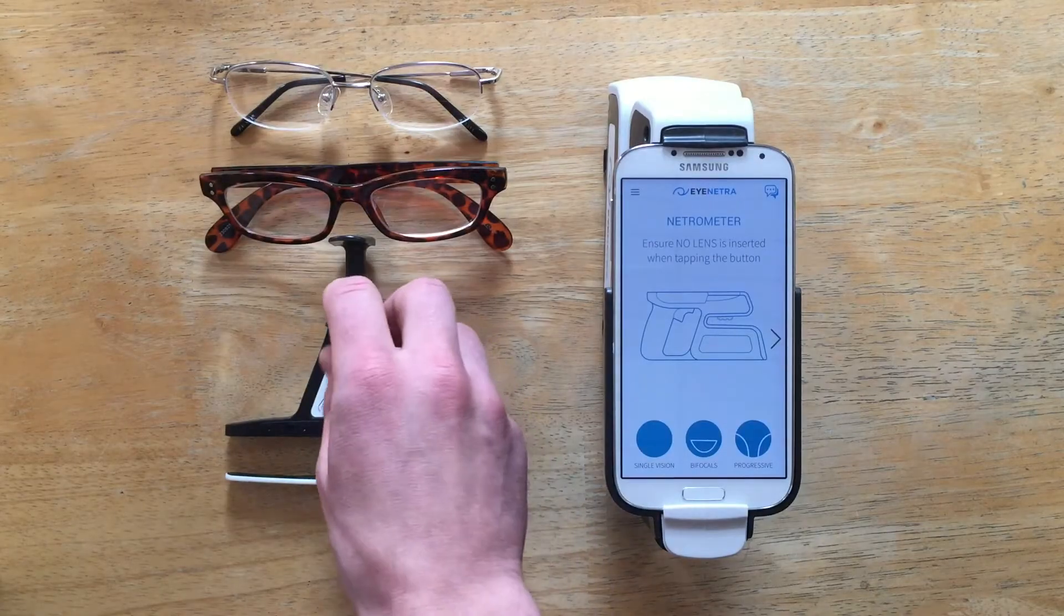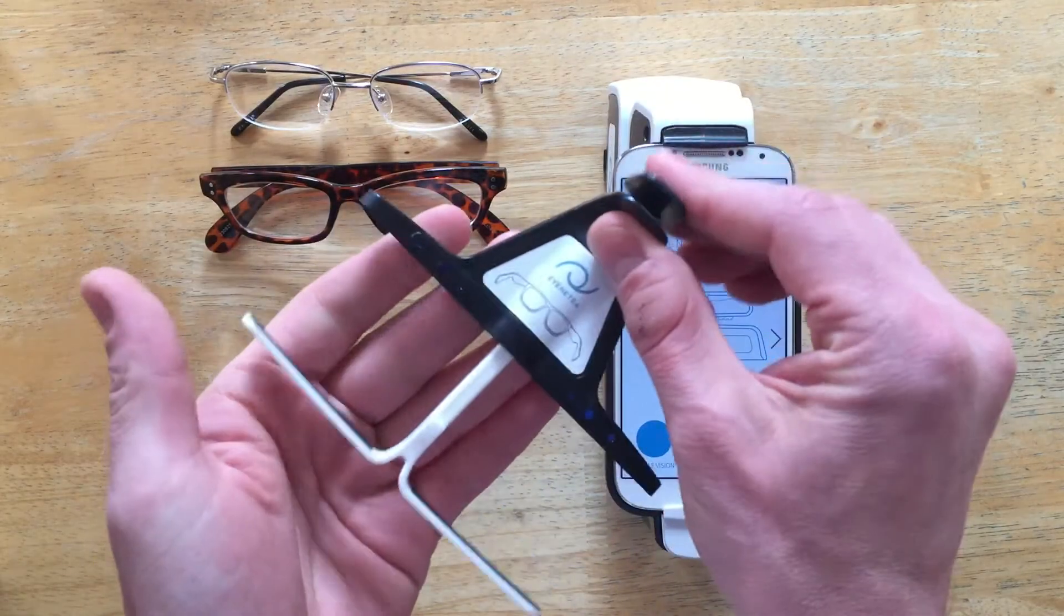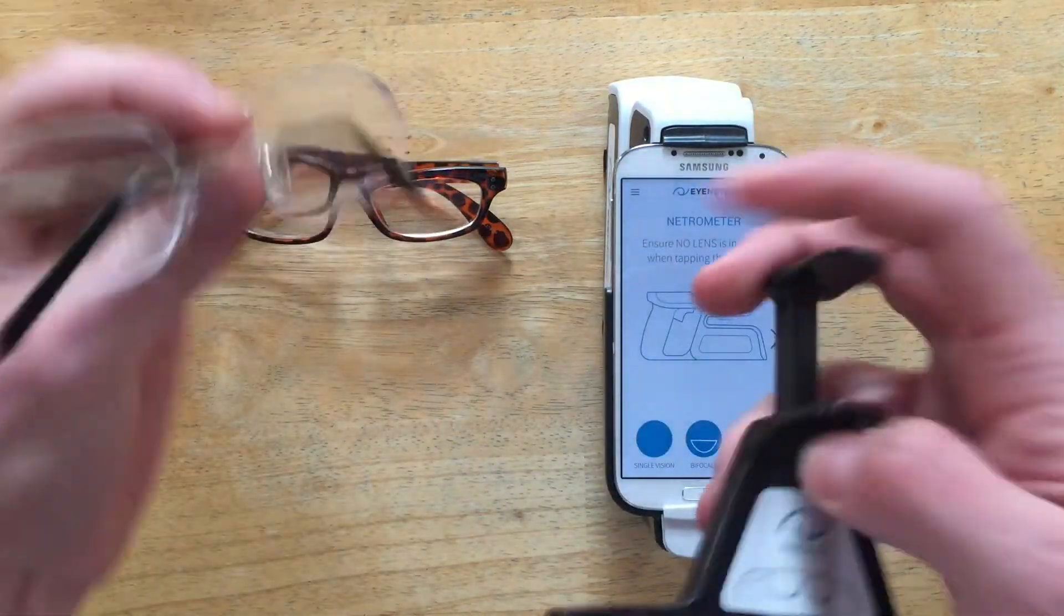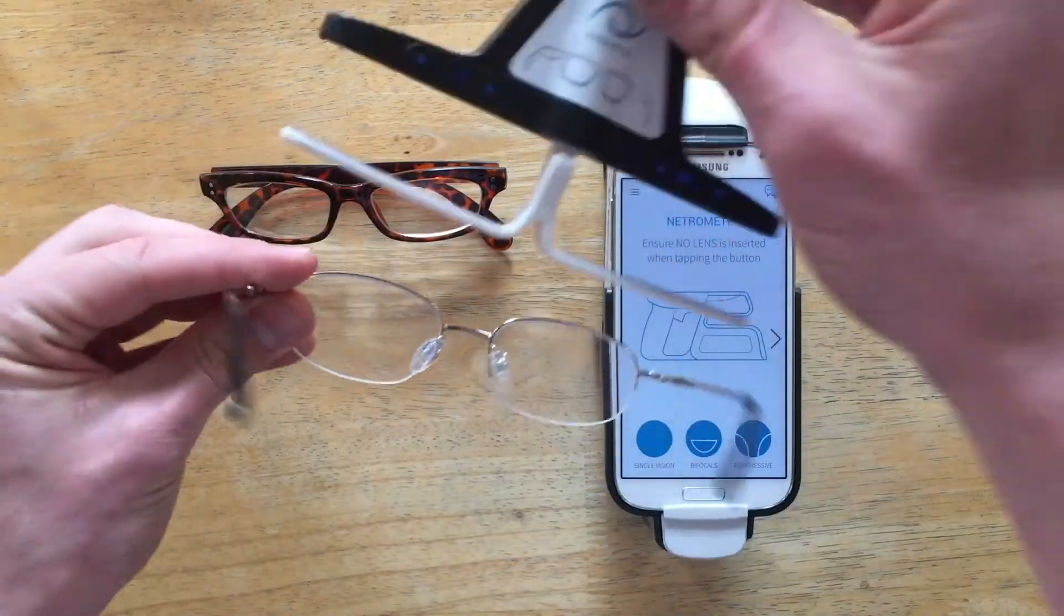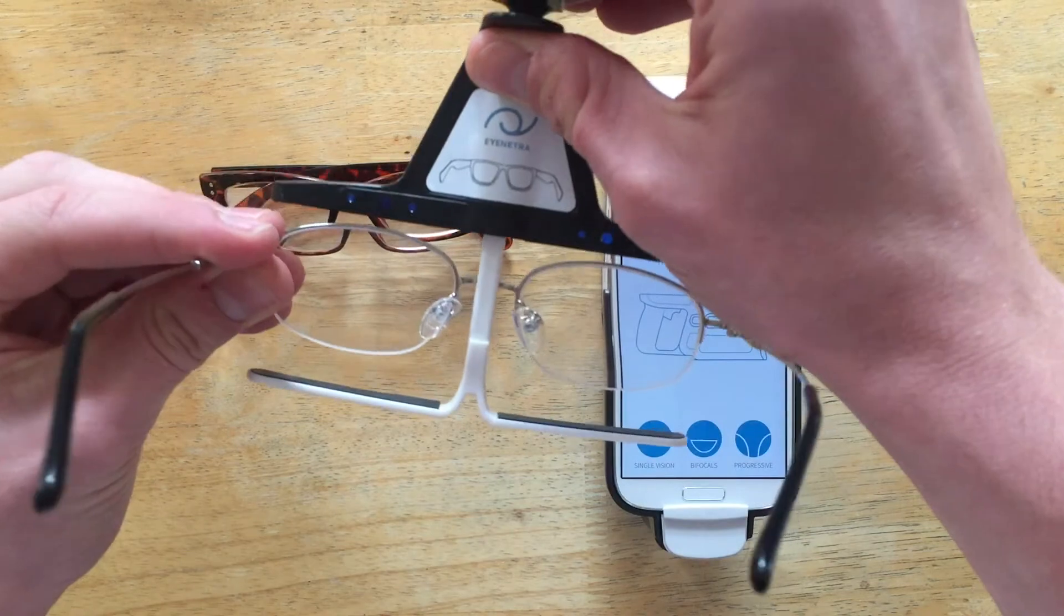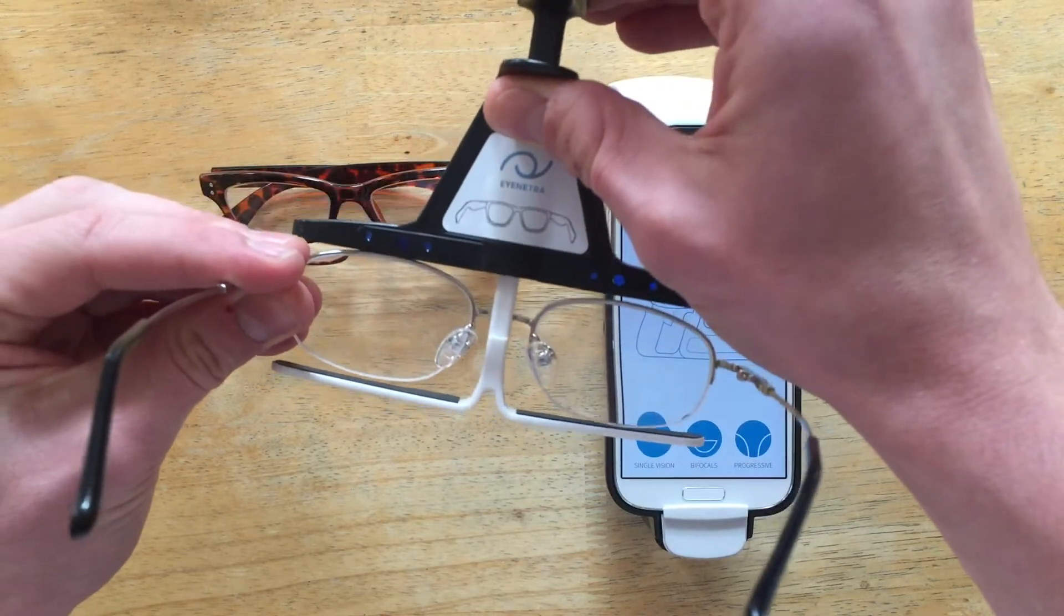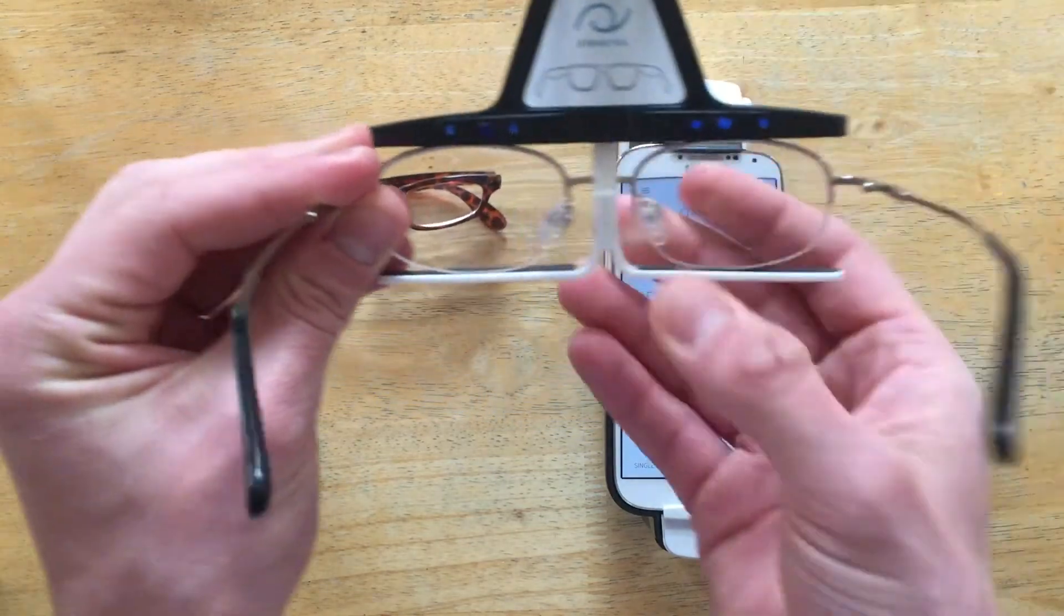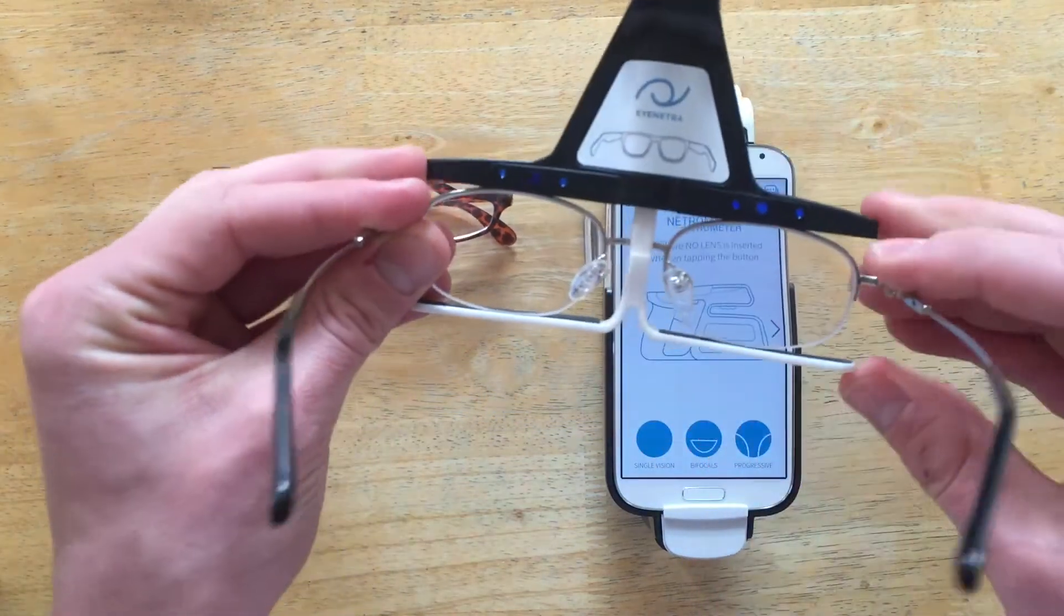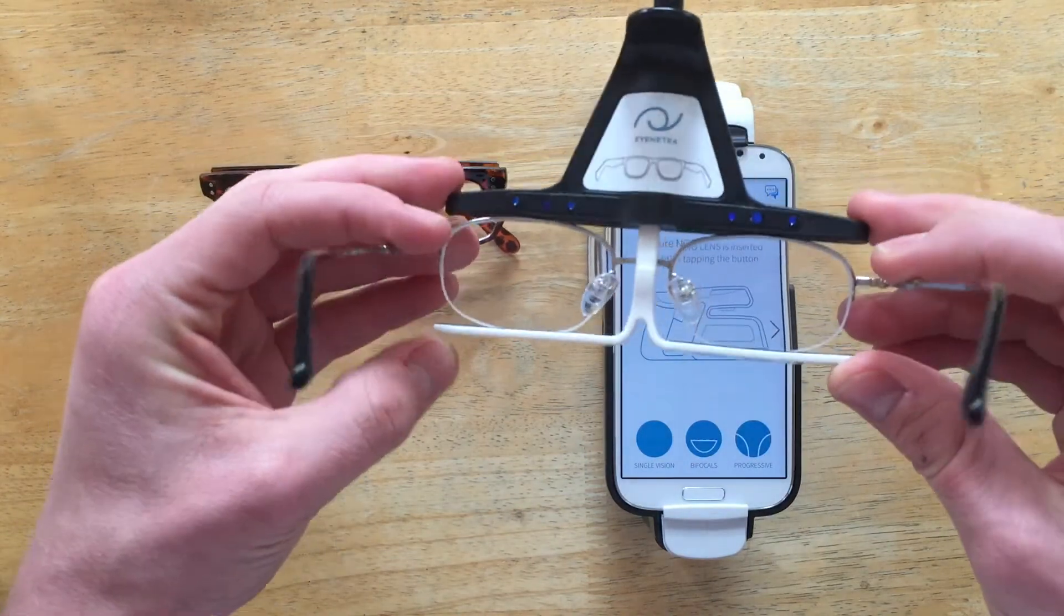So let's show you how it works. First things first, to attach the Smart Stage to your glasses, simply open the clamp and then just gently close it onto your frames, ensuring that the center post is centered on the bridge of the glasses, just like so.